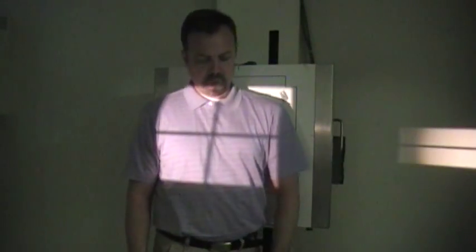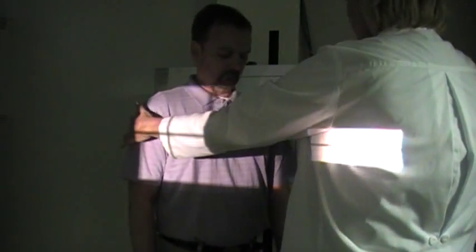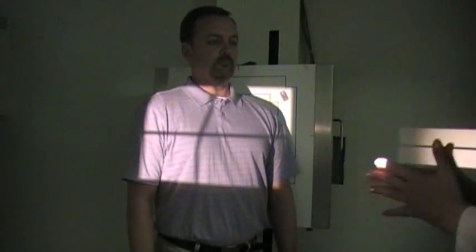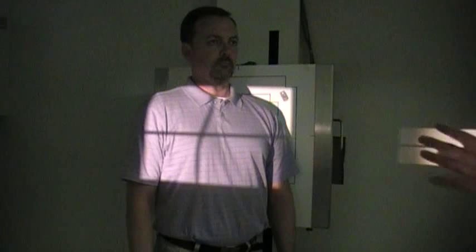Some doctors request a special projection of the chest by doing obliques. So I'm going to show you a left oblique of the lung. Again, this is a special request. It's not normally in the routine. So I'm going to turn David about 45 degrees. And what you want to check regarding chest x-ray obliques is that you want the light field to include both of the lungs.